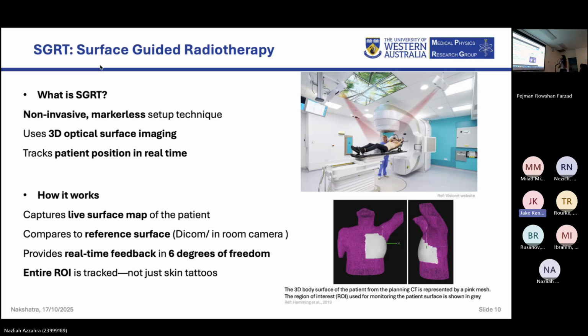Those are the cameras in the treatment room, and the bottom picture represents the surface created from the CT. The pink mesh is the surface, and the gray area is the region of interest.